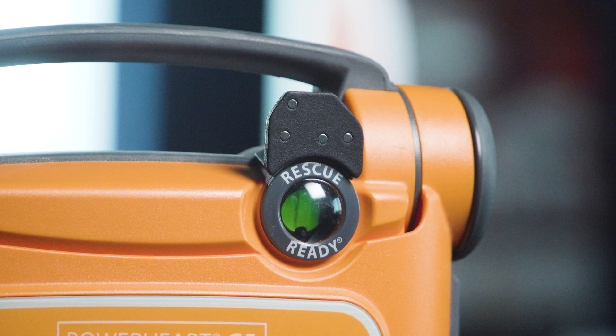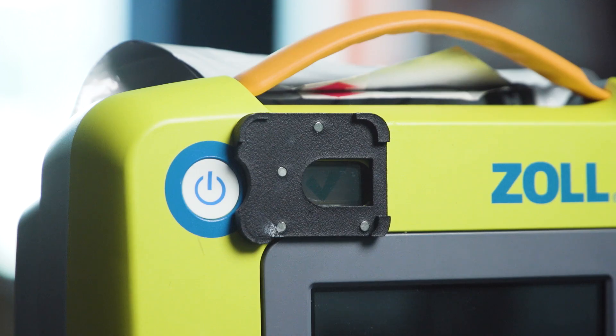If the AED has a static symbol, like a check mark, the sensor will turn solid green almost immediately.